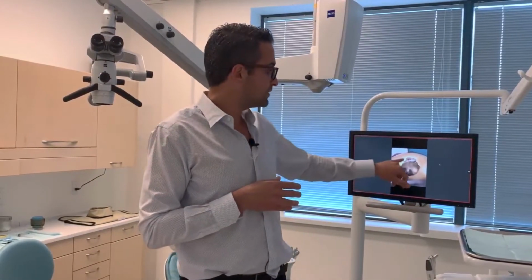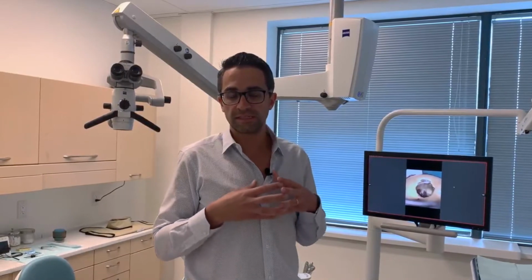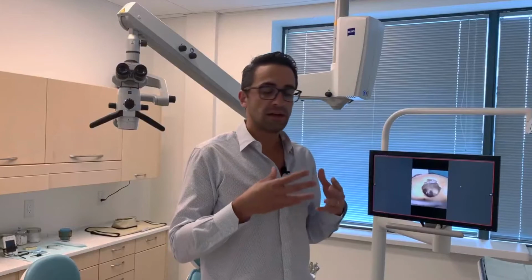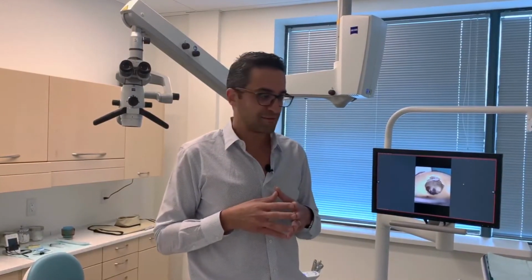Had we not used a dental operating microscope, we could not have detected this crack. Had we not used the CBCT, maybe we would have treated the other tooth rather than the right tooth. So all these tools and technology are important to be able to help us diagnose and treatment plan and help the patient, and ultimately fulfill our duties as a dentist, as an endodontist, or as an oral healthcare professional, which is to help the patient and put their well-being in front of any other interest that some of us might have.